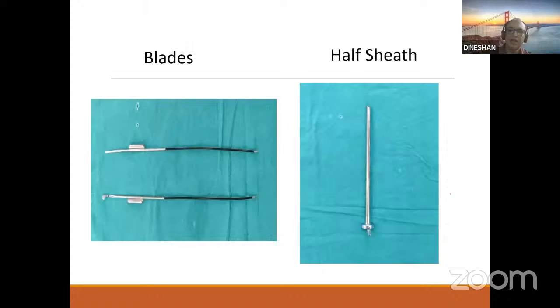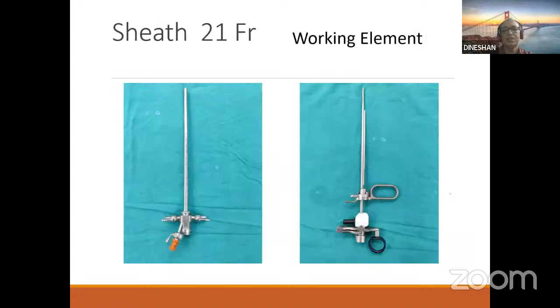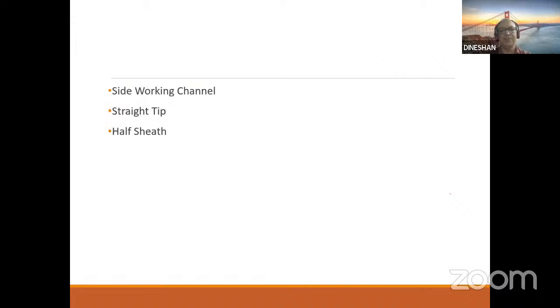Otherwise, another way of doing it, if you don't have the half sheath, is after you divide the stricture, you can pass a guide wire, retain the guide wire, and thread the catheter over the guide wire. These are the two ways in which you can manage a slightly difficult catheterization. But these are all when you use it for difficult strictures.